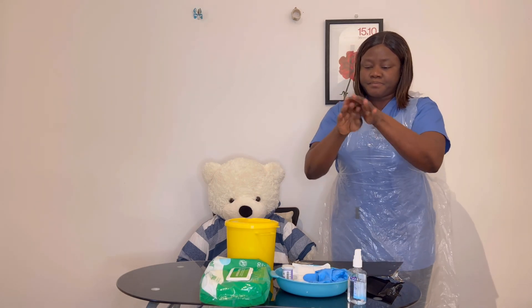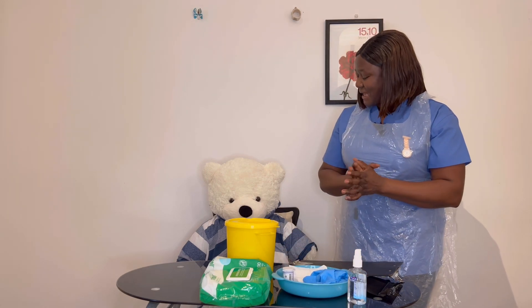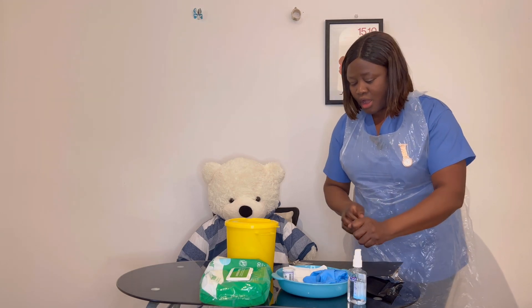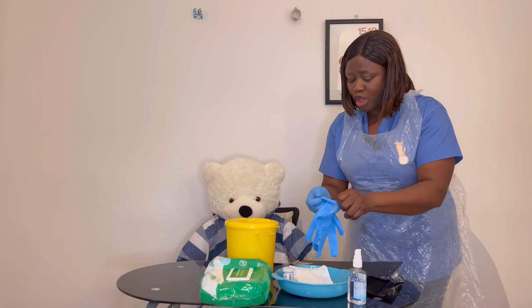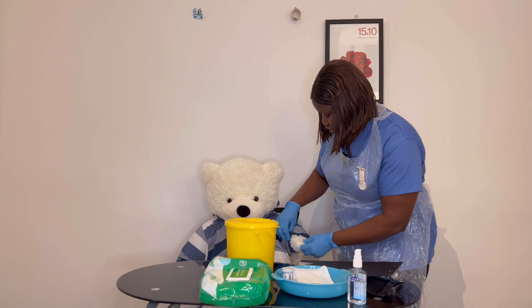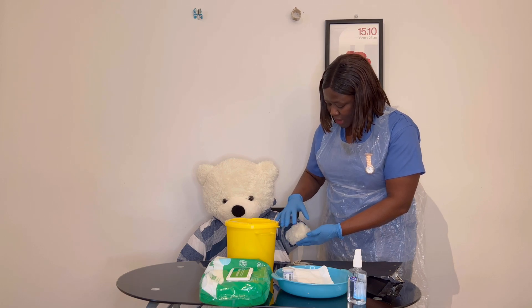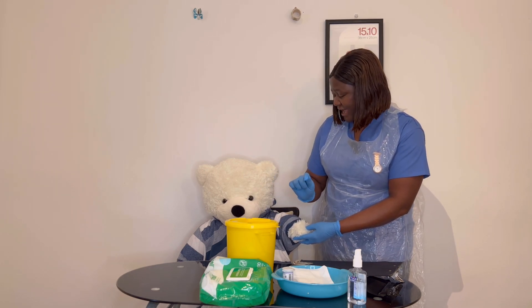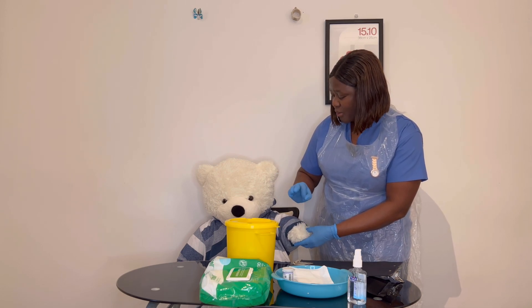I'll do my hand hygiene and go back to my patient. Hello James! I'm back — are you still happy for me to go ahead? Yes. I ensure the curtain is pulled to provide privacy. James, we'll be doing your blood glucose just before your meal. Can I just touch your fingers to check? I can see your fingers are visibly clean — not soiled. I'm not going to use your index or thumb as they are very sensitive. I'm going to use the other middle fingers, rotating each time so we don't use the same spot. Which finger did you use last time, James? The middle finger. Okay, I'll use the other one.